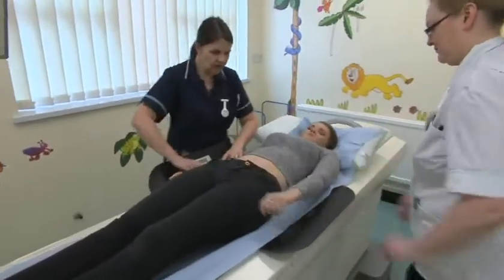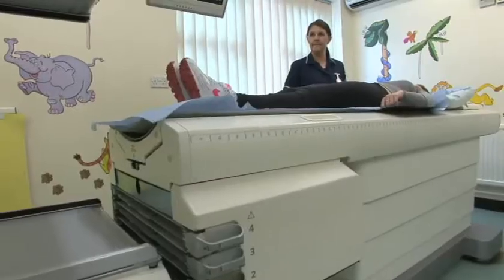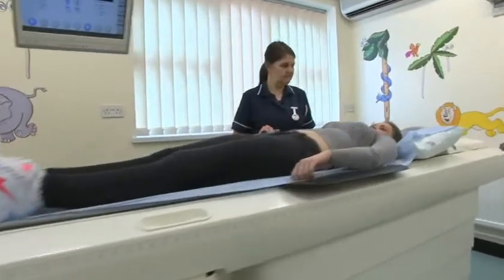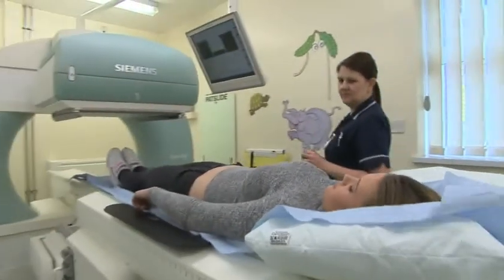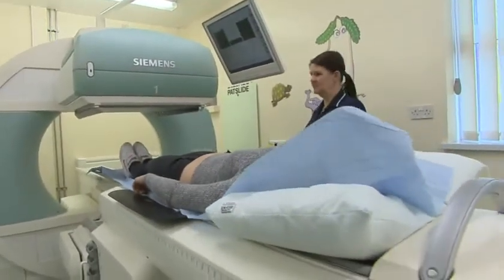A MAG3 Renogram is a kidney scan, and what that's looking for is to assess the drainage of the kidneys. We do MAG3 Renograms in children and in adults. The doctor refers the patients to us when they're concerned about a blockage in their kidneys.